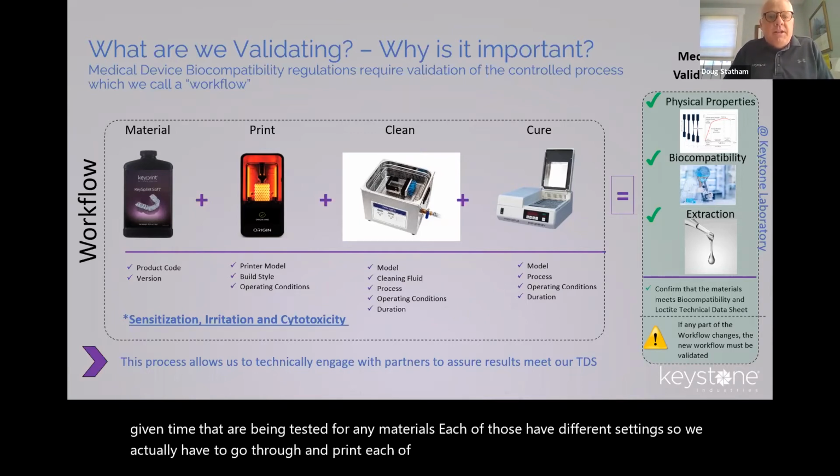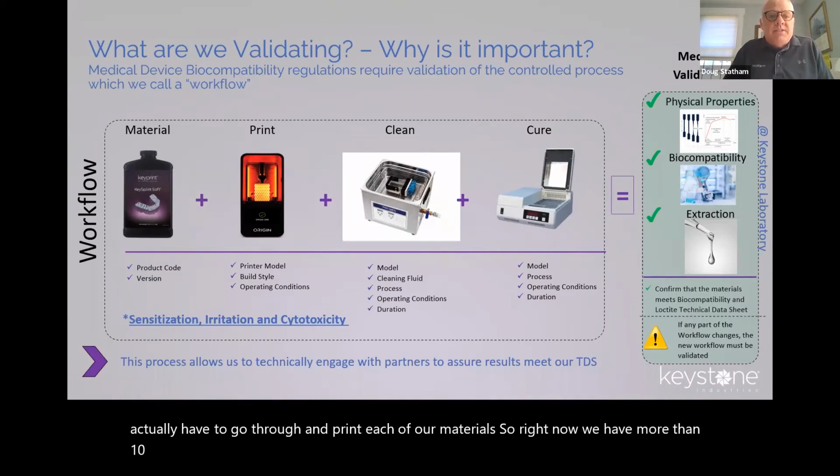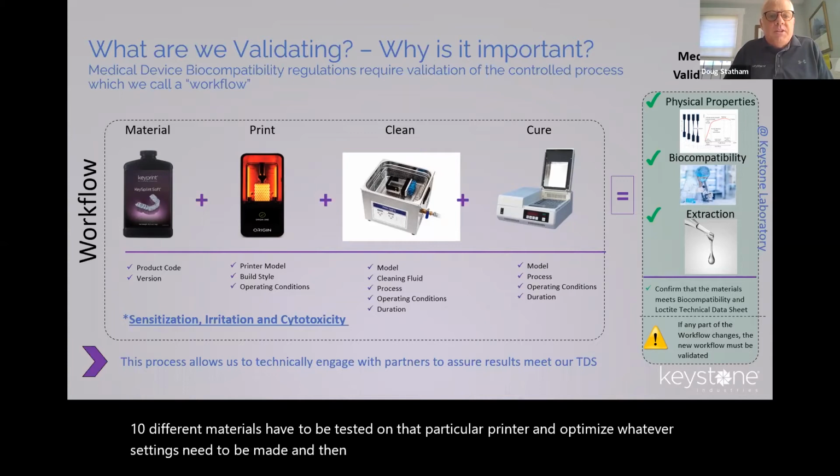And then we go through a cleaning process. This is a little more standardized. Most people are using a similar process on this, isopropyl alcohol and some sort of wash solution, just to rinse off a lot of the residue when you get done printing.